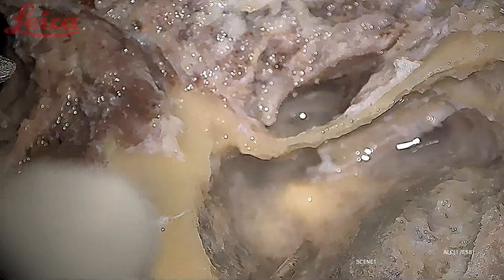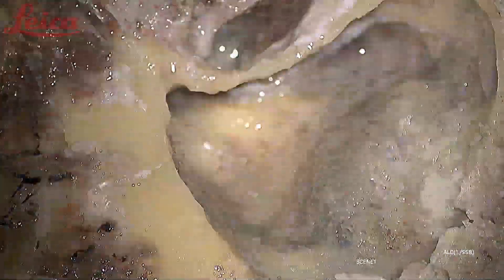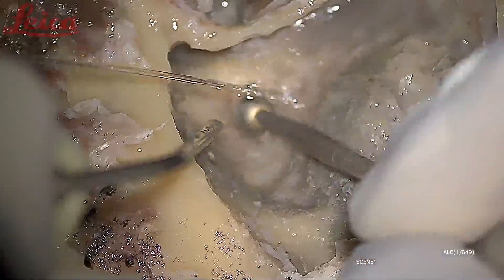After the break, next will be delineation of the semicircular canals and also an endolymphatic sac decompression. To do endolymphatic sac decompression, one has to drill out the posterior fossa dura and also remove all the bone over the sigmoid sinus.